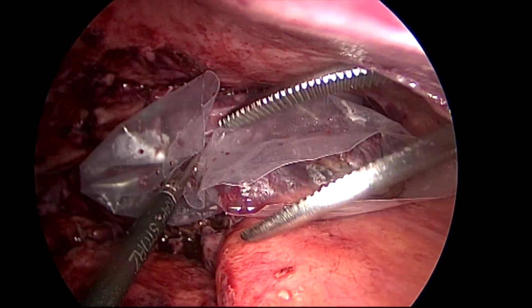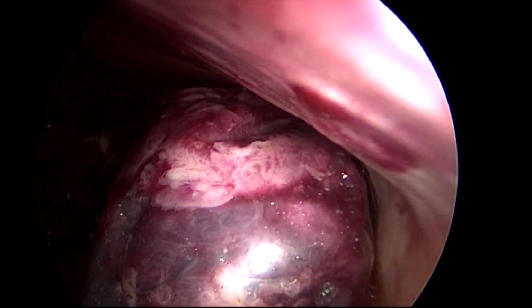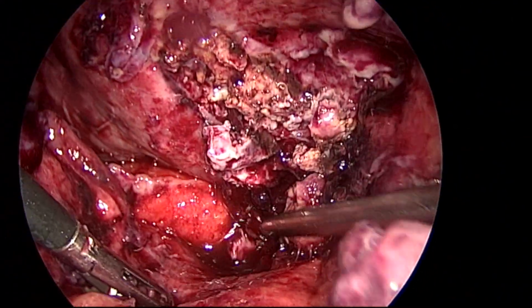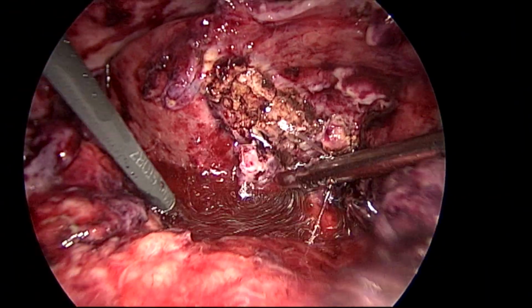So I put the Kelly clamp. I am taking out the bag. I take out all the contents and then I clear with betadine solution. The port site will be clean. Then finally we have to give a nice wash, and all the area is to be washed thoroughly.